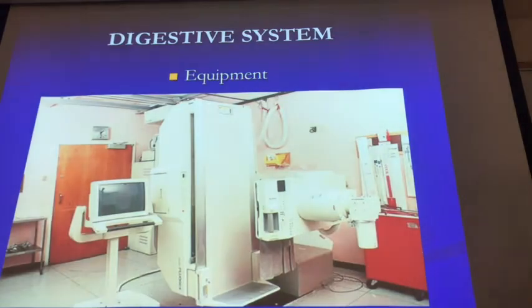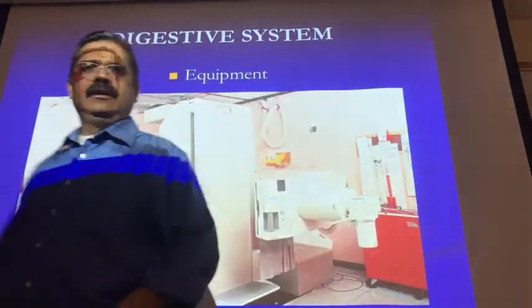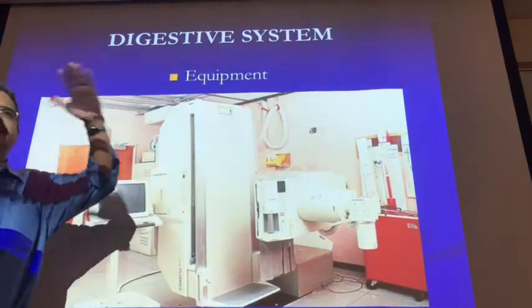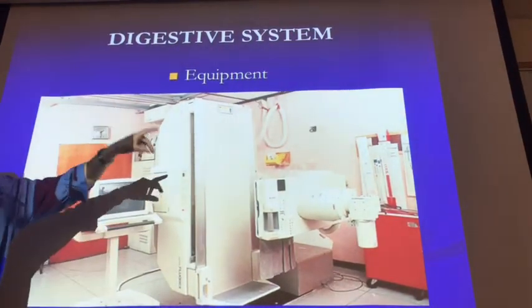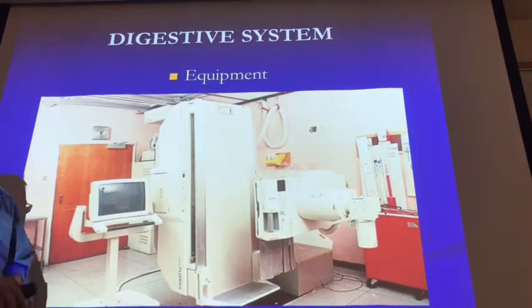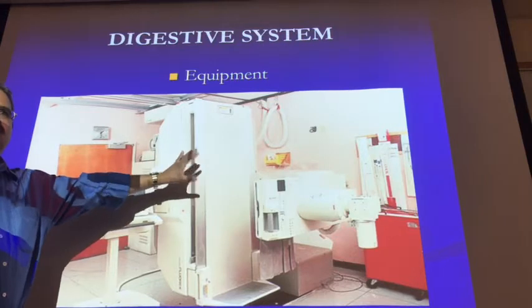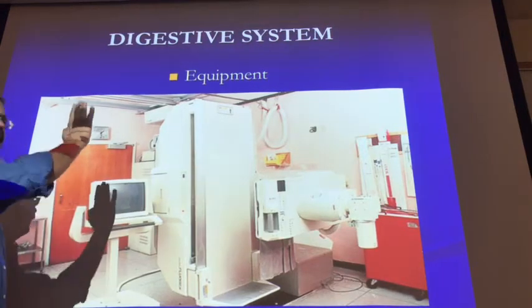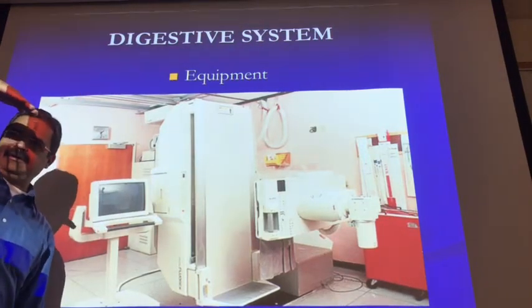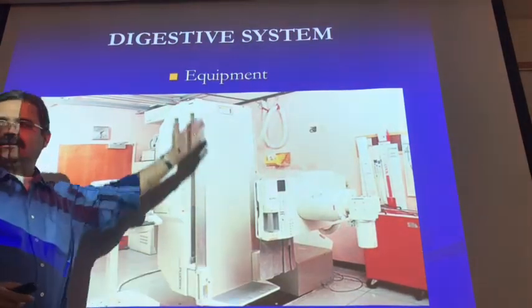Equipment, I already talked about. You have your image intensifier, you have a table, and fluoroscopy tables, they need to tilt. Okay, and remember from Tech 400, we talked about that's how you identify tables. 3090, 2090, okay. The first number tells you that now the patient goes in Trendelenburg, okay? And the 90 tells you can bring the patient upright.